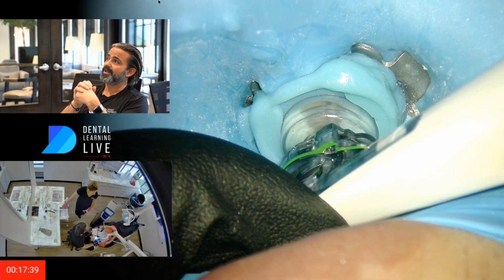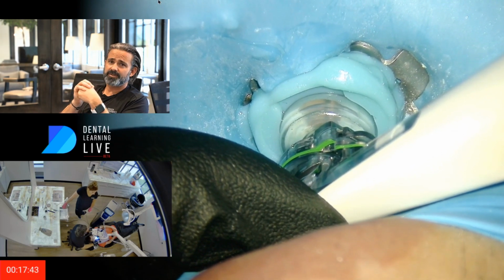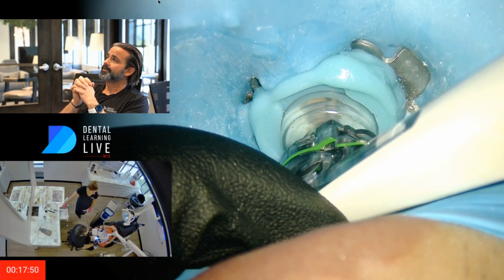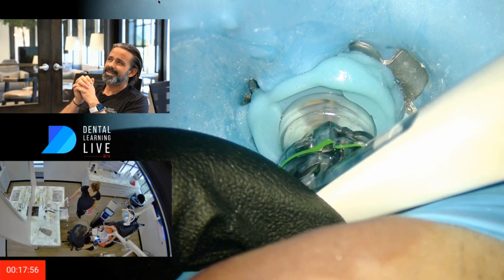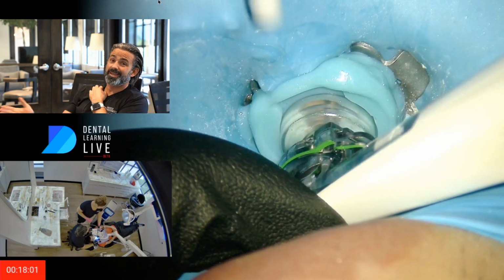All right. Still see the puff of pink clouds. I just noticed it there. 17 minutes, 42 seconds into this case. And the other thing, if you go back on the video as I was narrating this, pay attention to that lateral anatomy, that isthmus anatomy, and what that looked like pre-GentleWave.